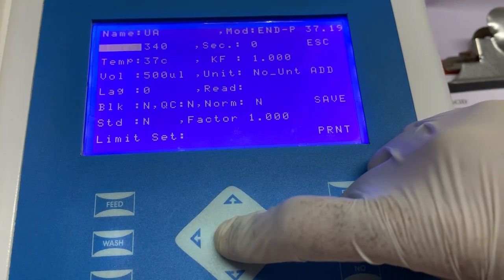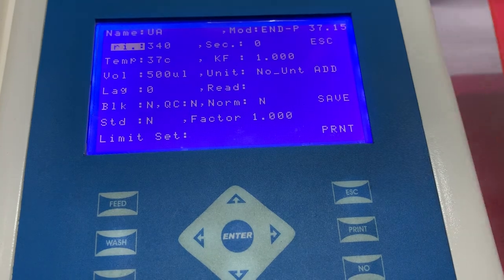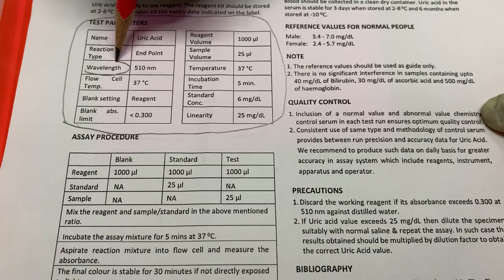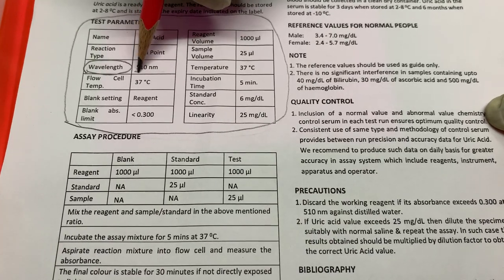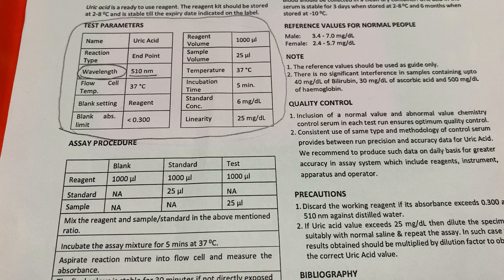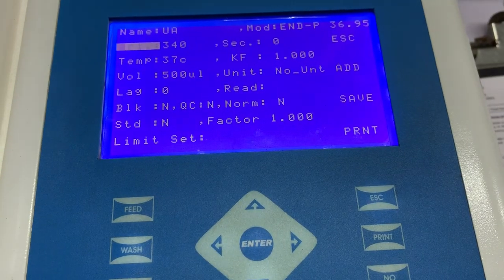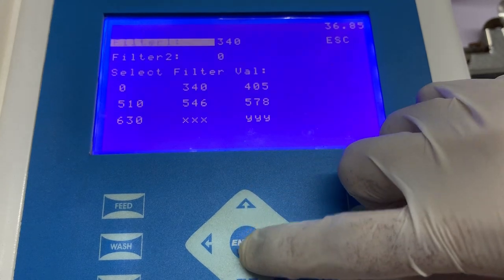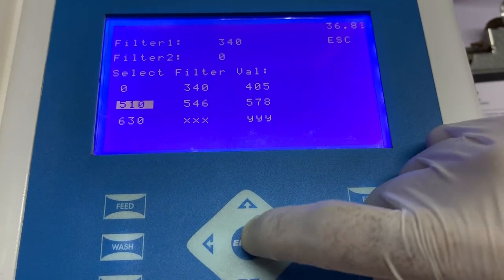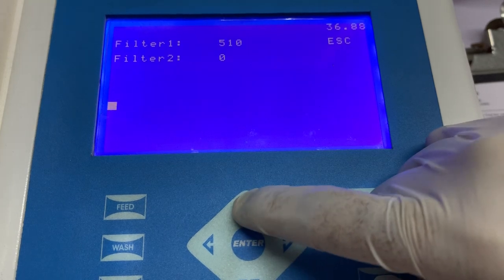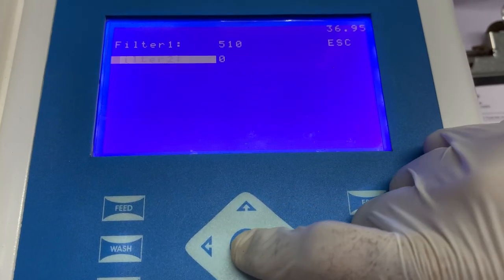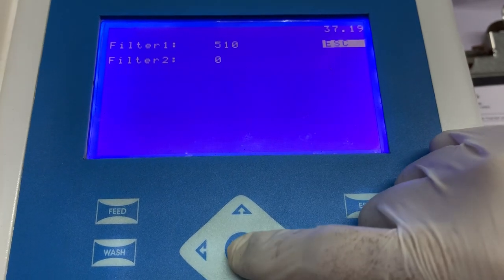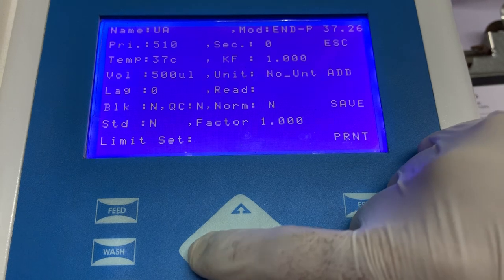The next information that needs to be entered is primary wavelength. This information can be seen in the instructions for use, where the manufacturer clearly mentions at what wavelength the absorbance needs to be taken. Here we will select the option of primary filter and select filter number one, and from the list we will select the wavelength mentioned in the instructions for use. As the manufacturer has not given any information about secondary filter, we will leave this option blank. Press escape to come back to the home screen.